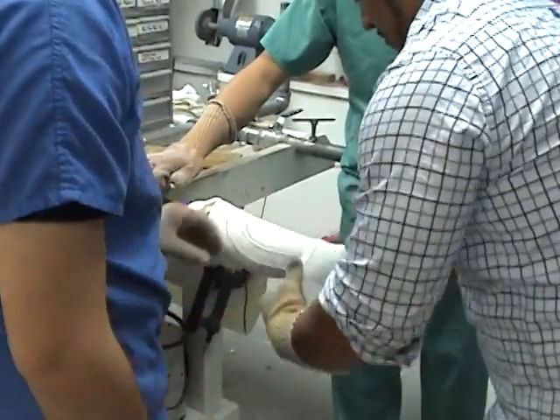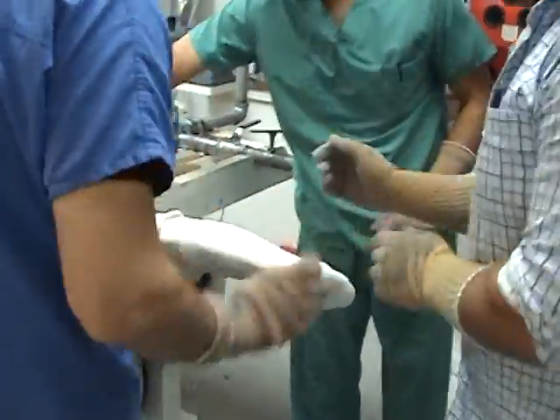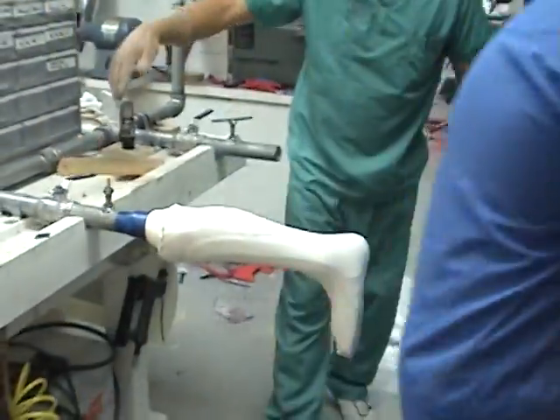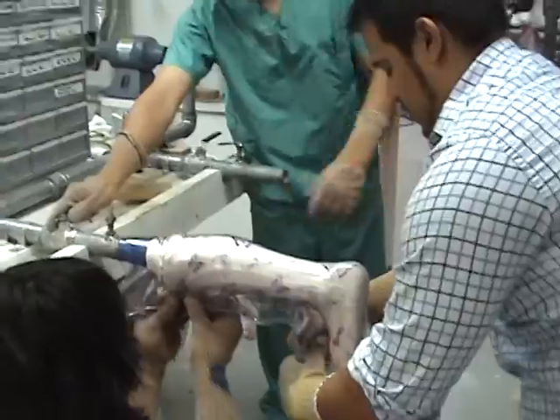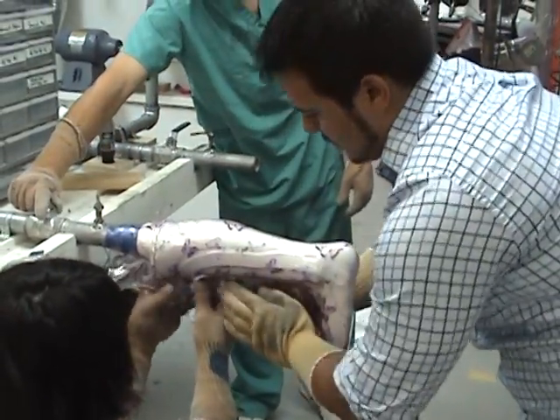Run the nylon up. Flip it. And now plastic. You've got to be quick, and they are quick.